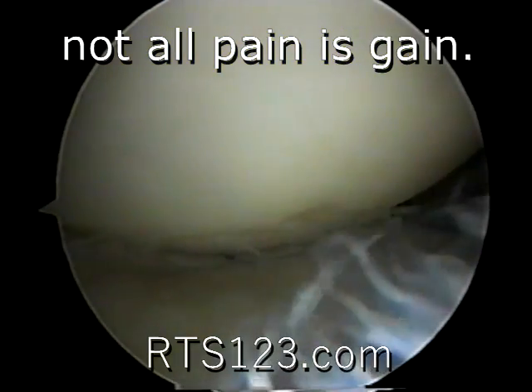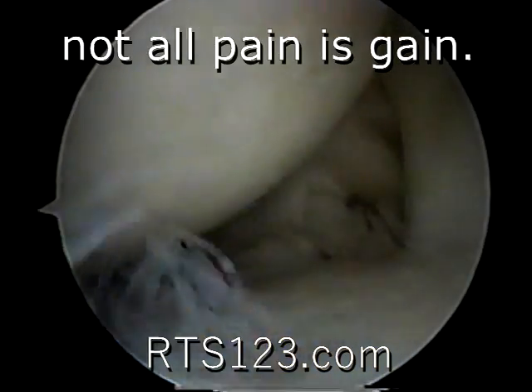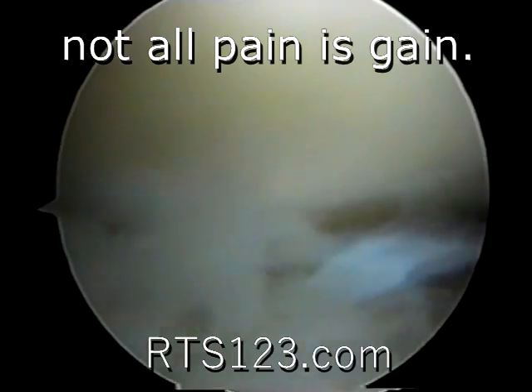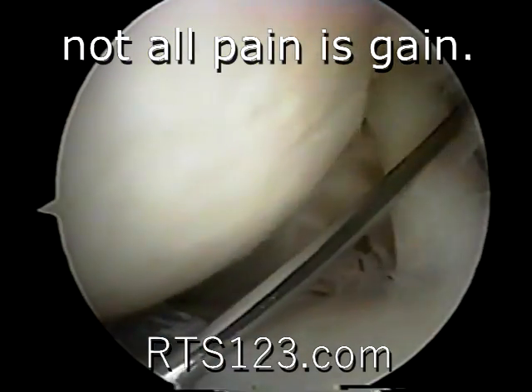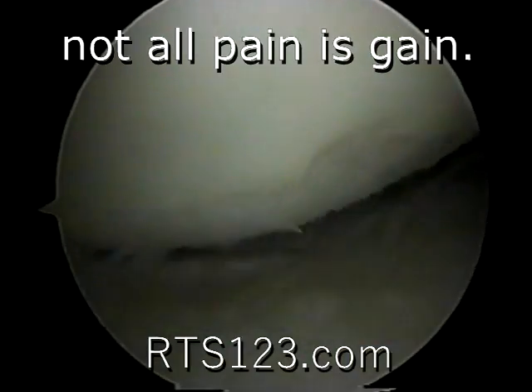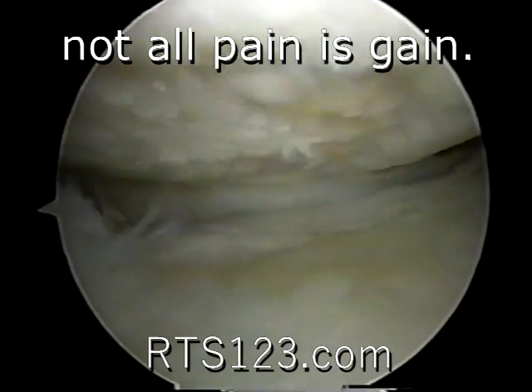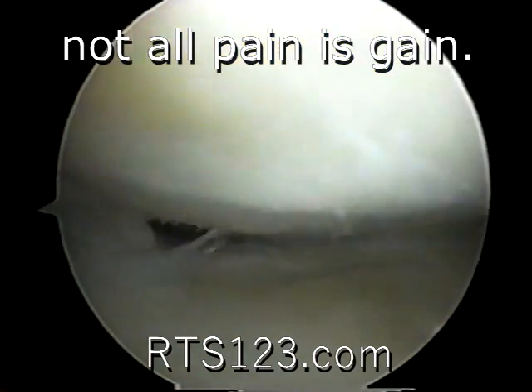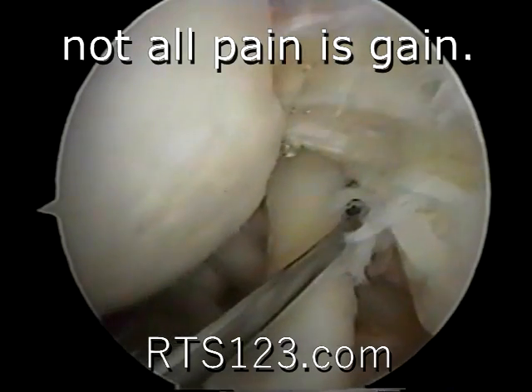Now you do have a lot of debris in this shoulder that we're going to clean up. I'm going to polish this cartilage tear up in here. I'm going to trim the cartilage down here inferiorly as well. We'll put a shaver in and tidy this up. But you can see that this shoulder has just realized too many miles, too much stress over the years, because this is the worst part of it right here. No matter what we do to your rotator cuff, you're going to have achy, deep, achy pain in the shoulder every day of your life because of this bone rubbing on joint surface.